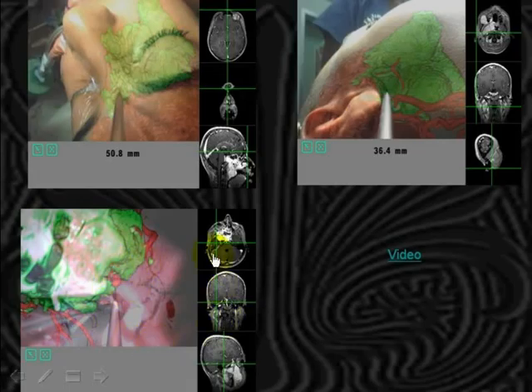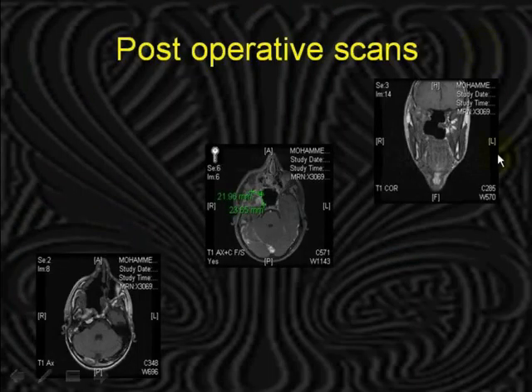This is an intraoperative image looking at the posterior aspect of the tumor. This is really with the low inferior towards, looking at where the carotid artery is. Able to resect this tumor with a big hole here, a small amount of tumor in the cavernous sinus, which is treated with radiosurgery.